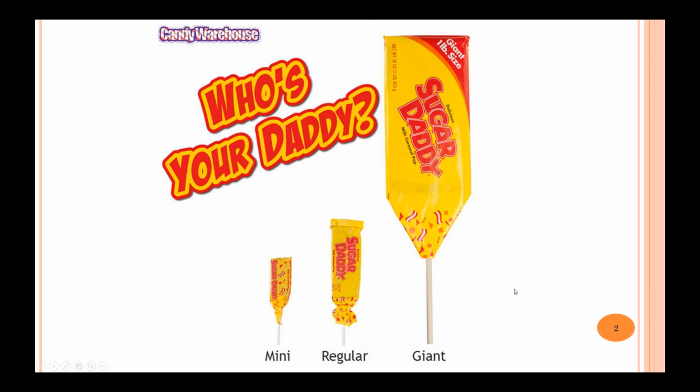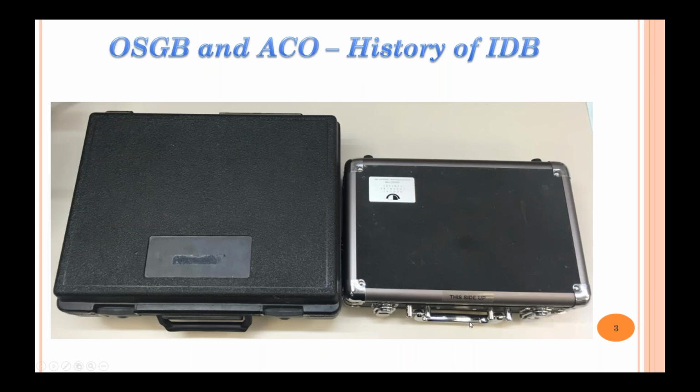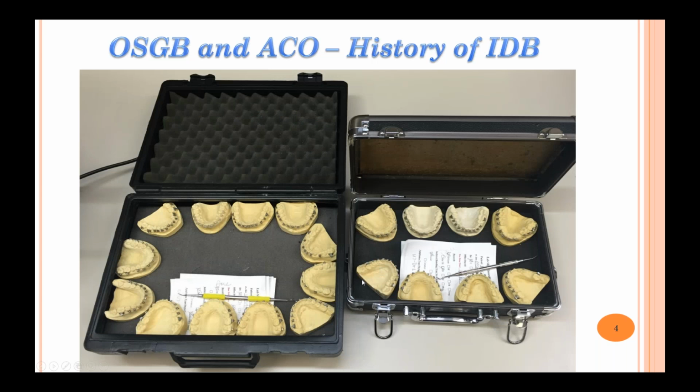Now look at where things have gone. Those of us who have been involved with indirect bonding probably know what these are. These are the black boxes, to keep light out. This actually just happened this past spring. One of my lab techs dropped off two of these black boxes on my desk right at the end of the day, right around 5 o'clock, just getting ready to finish up clinic.